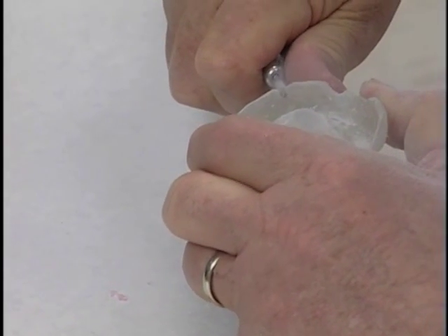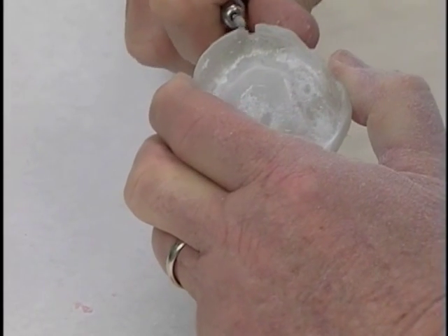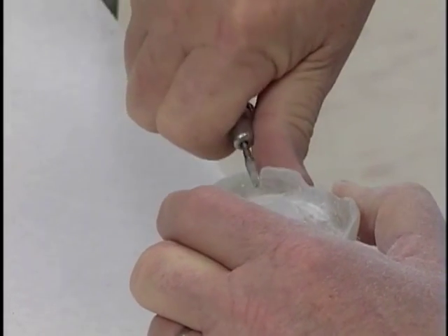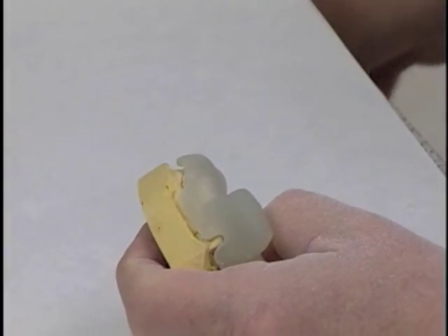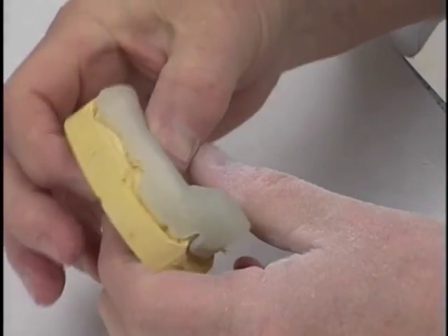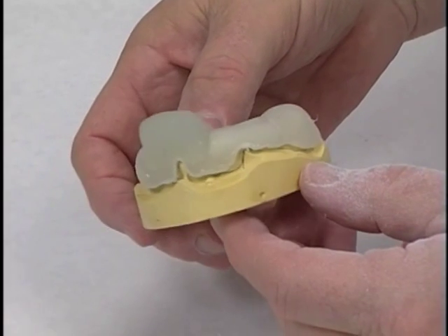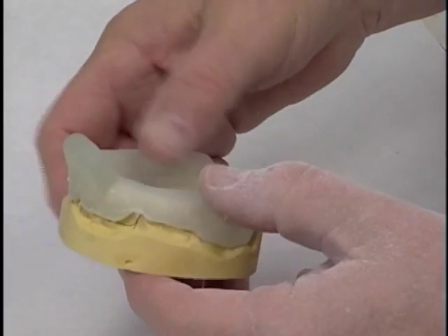And that's almost vertical. We do that one. And just round it in a little bit in all directions so we don't end up with sharp edges on it. Now this tray is pretty well trimmed as we would like it to be when we try it in the patient's mouth.